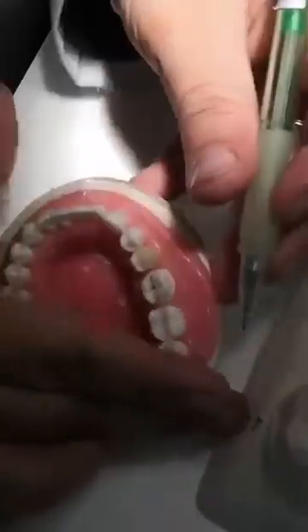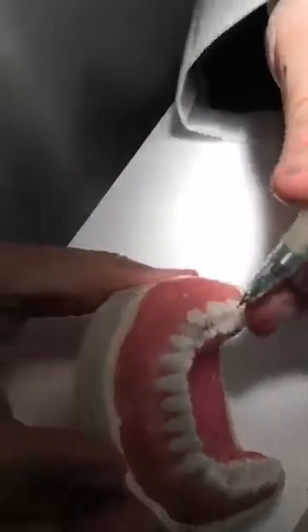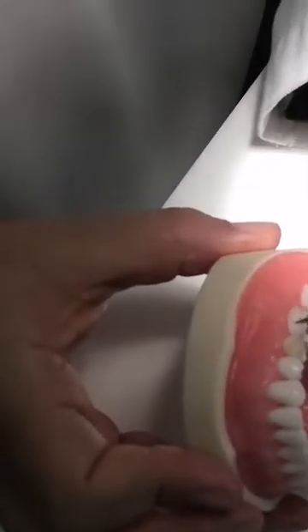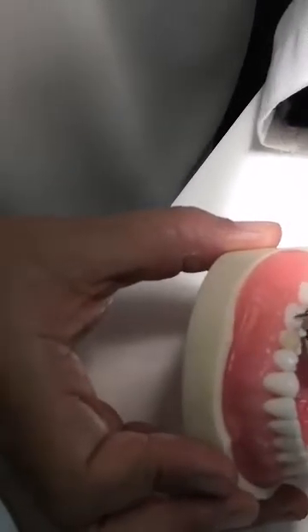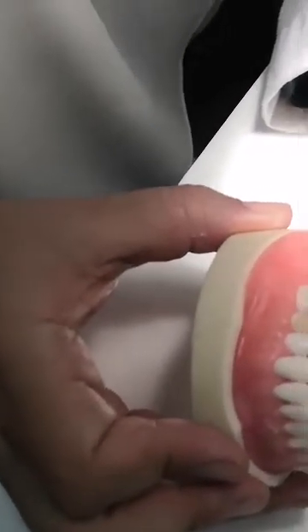So that's correct. Looking at it axially, I could see that you have two planes — a plane here, a plane here, and a plane here. They are separate. I could see that this ridge is separate from the central area. I could feel that you're going with the anatomy of the tooth. So that's correct.